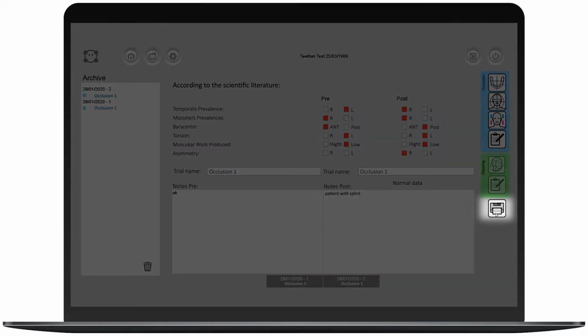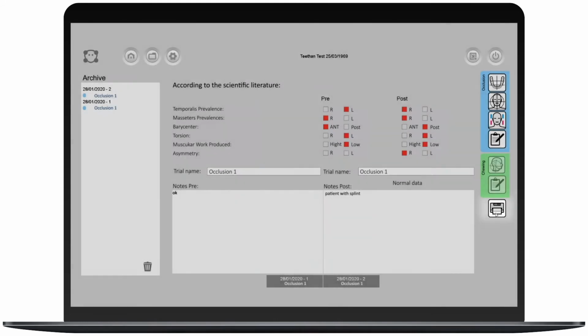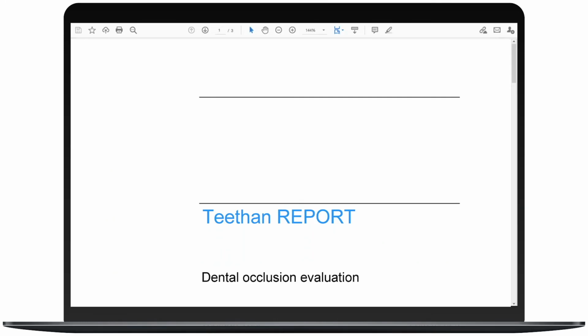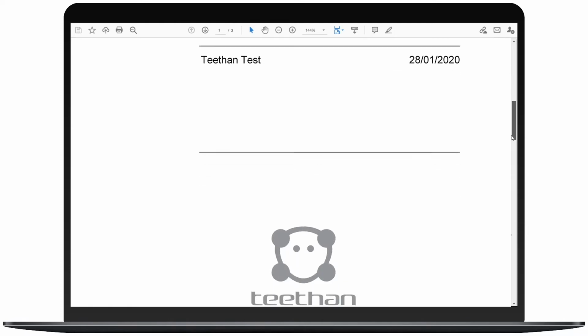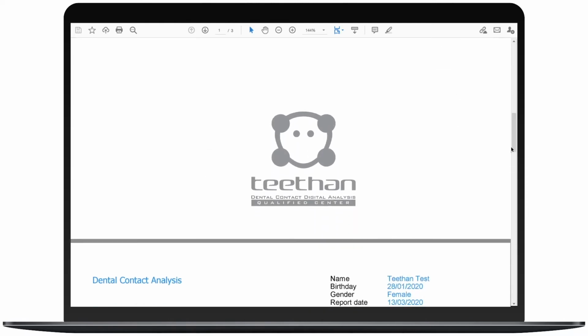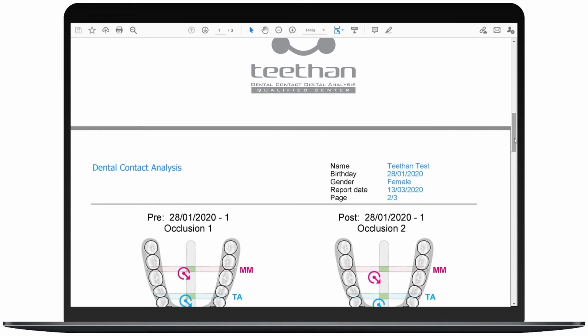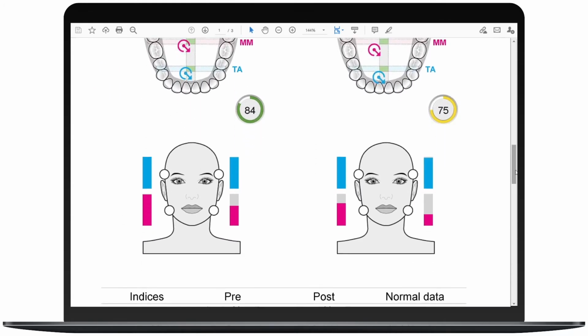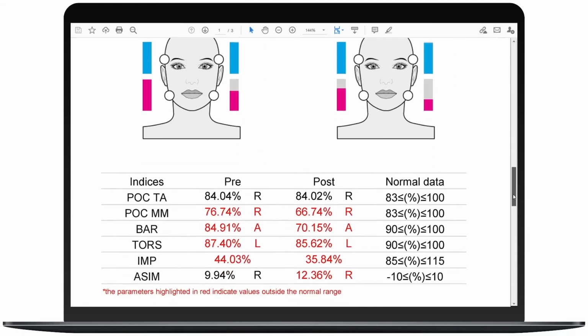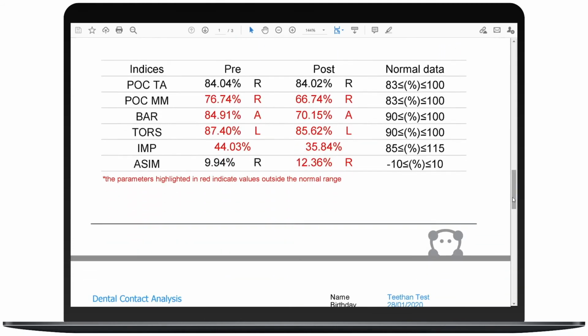To save the report, press the printer button in the bottom right-hand corner and a PDF report will be opened which contains the patient's name, surname, gender and report date. The report displays the Teethan indexes and representations, an automatic analysis of the indexes, and the notes previously inserted.